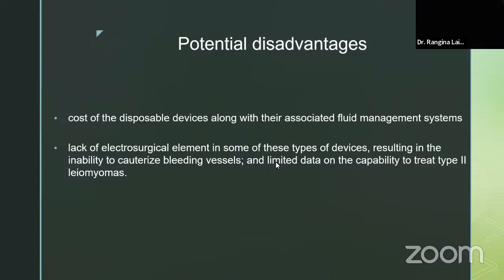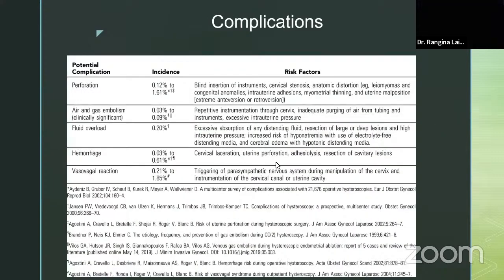Usually the companies say it is a disposable device that you can dispose of after a single use, but due to patient compliance and low socioeconomic status, we usually don't dispose of the instruments like scissors, even the resectoscope, after a single use. We re-sterilize them and use them.